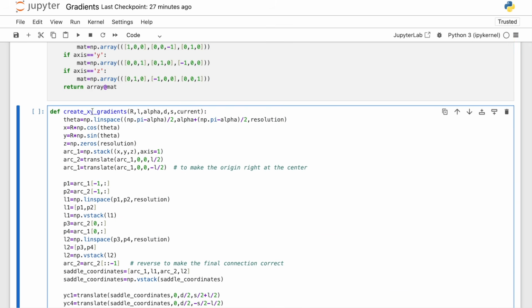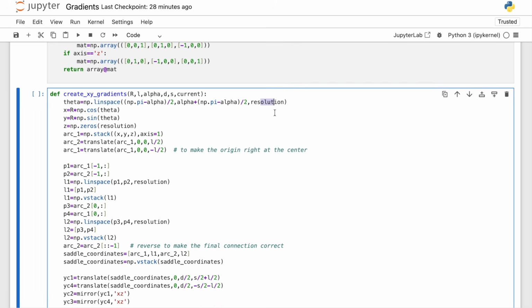So how we do this is first we parameterize the arcs, which is done by creating a variable theta, which goes from (pi minus alpha) over 2 to alpha plus (pi minus alpha) over 2 in resolution number of steps. The resolution will be hard-coded globally in order to avoid shape mismatches and to be consistent within functions. The rest is simple parameterization of a circle. So x, y is r cosine theta and r sine theta respectively, and z is an array of zeros with resolution number of elements. So why is it like this? Because initially, as we showed in the presentation, the base saddle coil is centered at the origin.